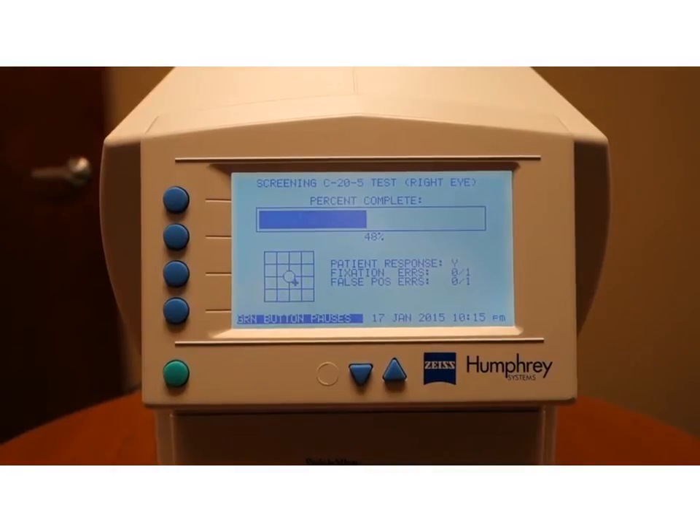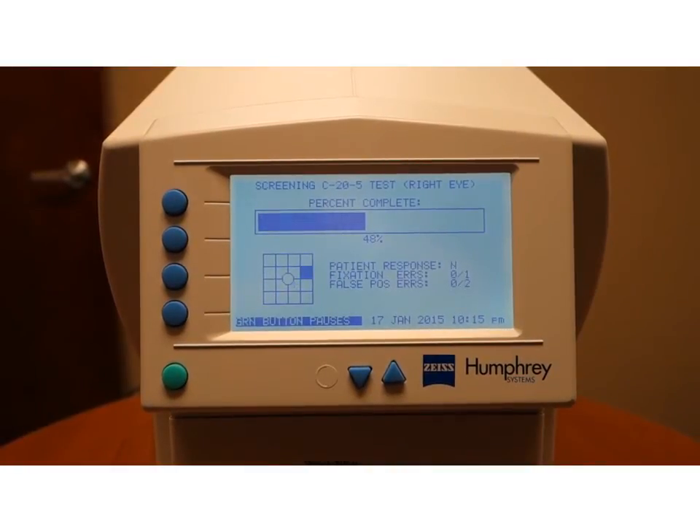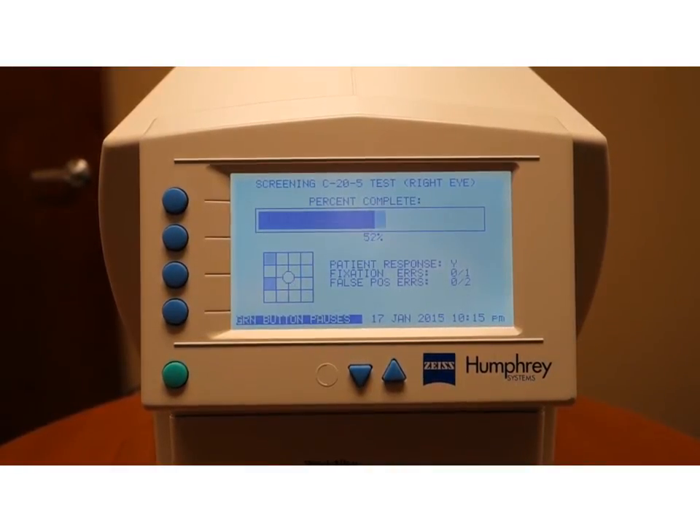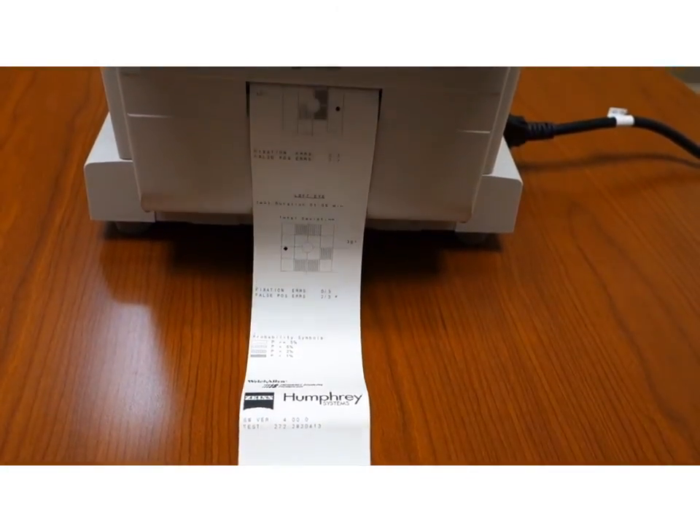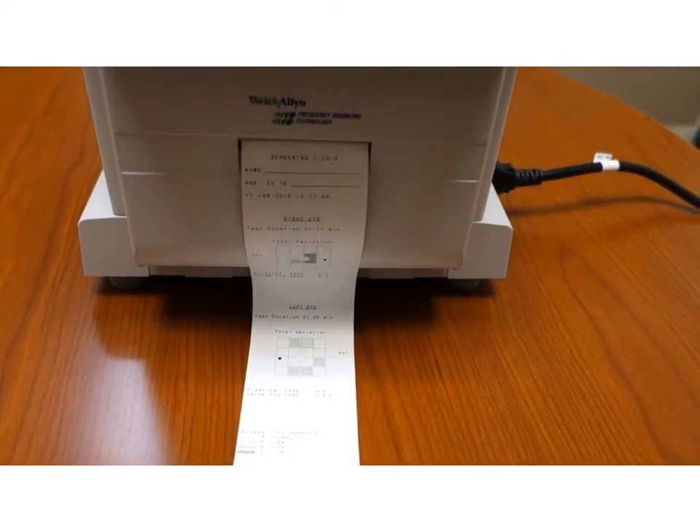While the patient is completing the test, your screen will display a map of where the stimuli are, and it will also tell you when the test is complete. Once the test is finished, the machine will print the results automatically.